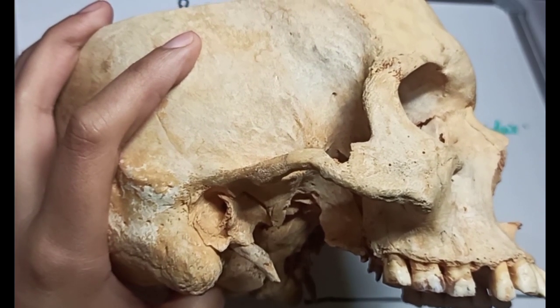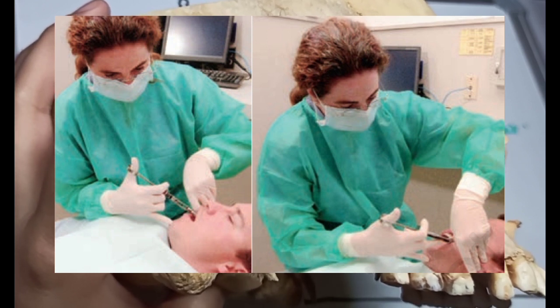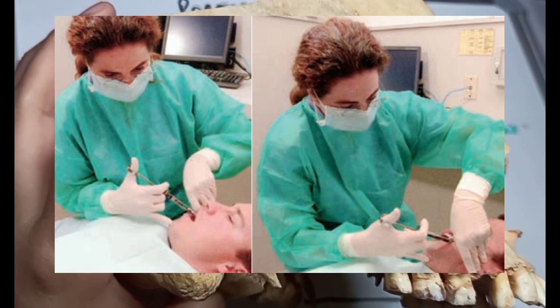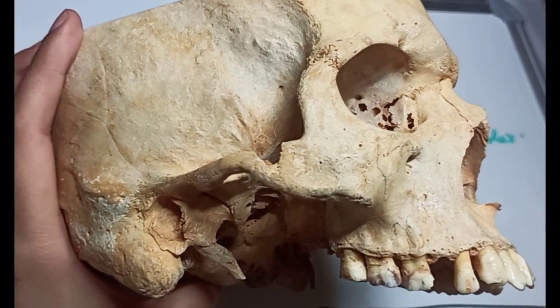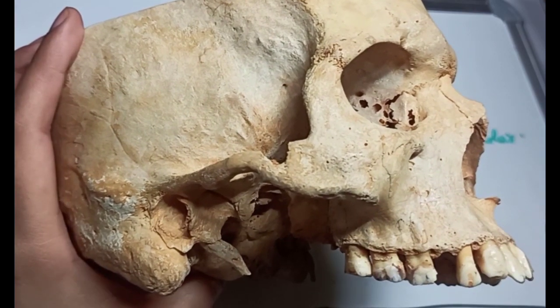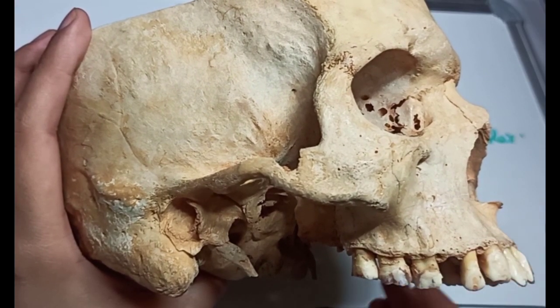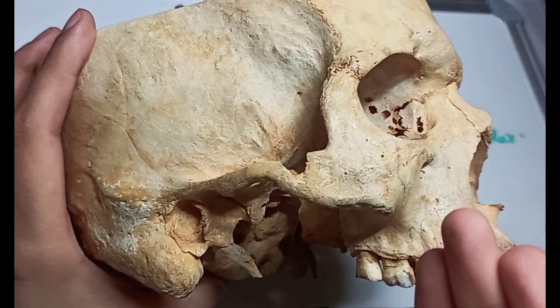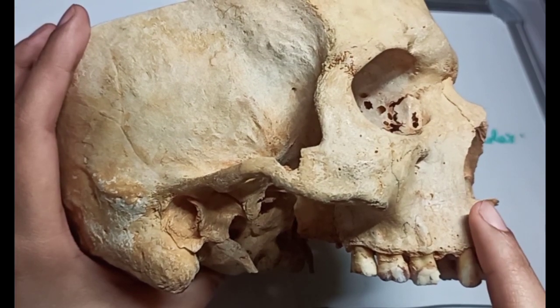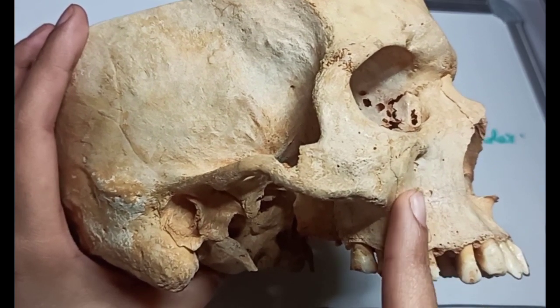For the left posterior superior alveolar nerve block, the right-handed administrator should sit at the 10 o'clock position facing the patient, and for a right PSA, the right-handed administrator should sit at the 8 o'clock position facing the patient. The bevel is always oriented towards the bone. Partially open the patient's mouth, pulling the mandible on the side of the injection, and retract the patient's cheek with a finger. This will improve visibility and reach to the injection side. Then move the forefinger over the mucobuccal fold in a posterior direction from the bicuspid area until the zygomatic process of the maxilla is reached.